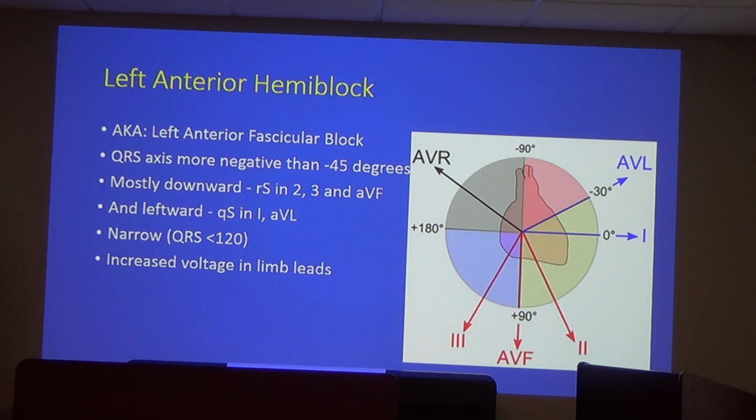For the augmented leads, you take those 3 leads and put a central 0 spot in the middle, and from there straight down to the foot is at 90 degrees, and that's AVF. AVR and AVL are at different angles compared to that. So it's just an interesting way to look at it.